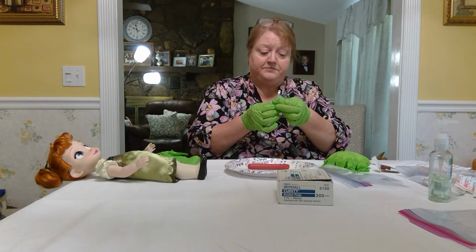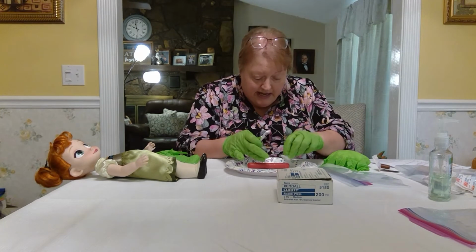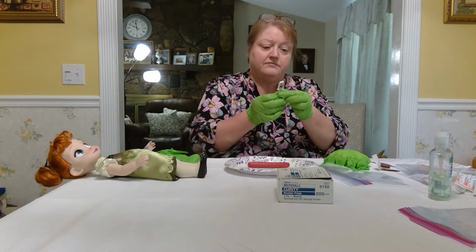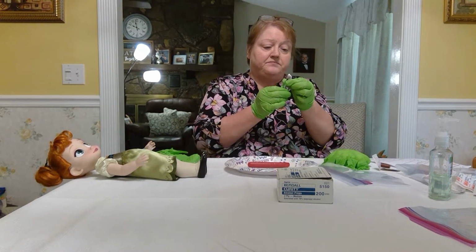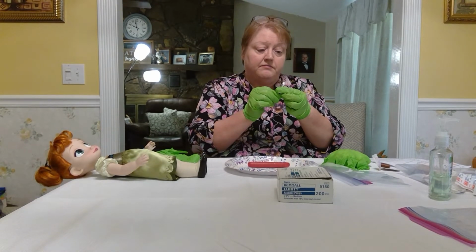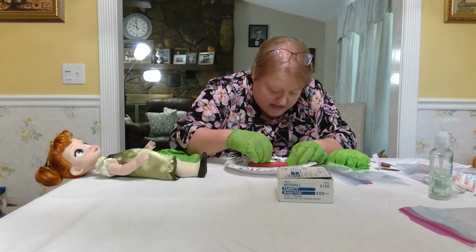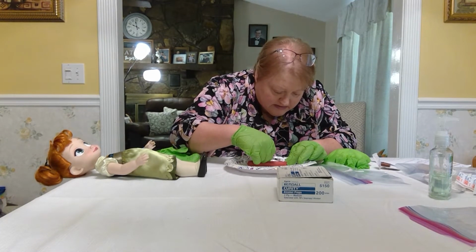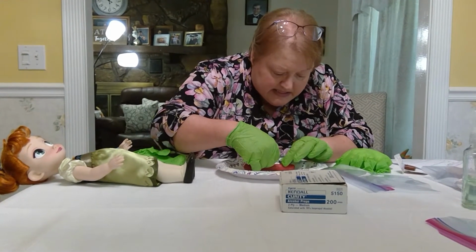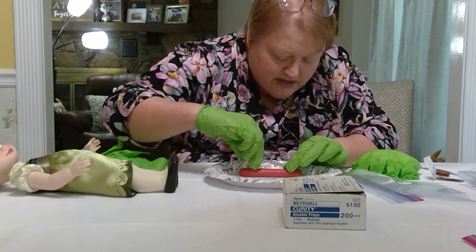Remove my cap. As I said, we have cleaned the area that we're going to be injecting into. I want to go bevel up at a 15-degree angle. Stabilizing the location. Stabilize the needle as you inject your full dose of medication.